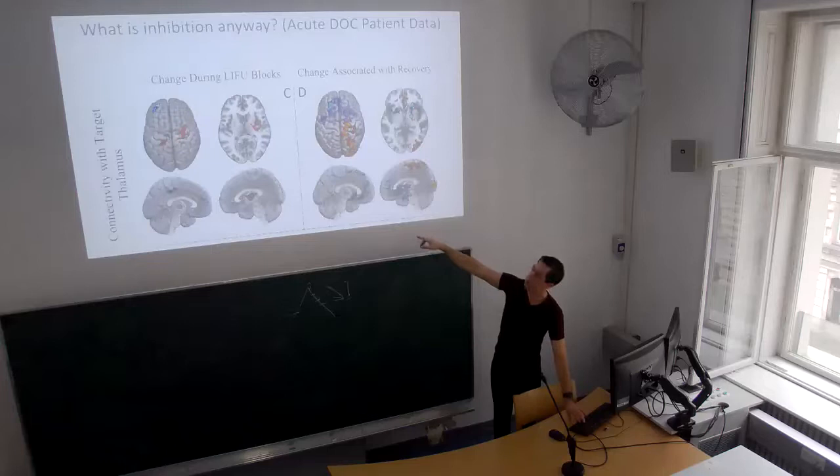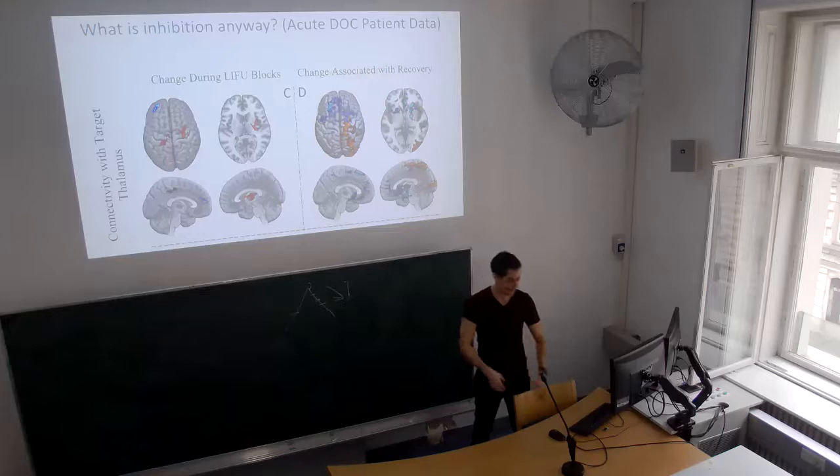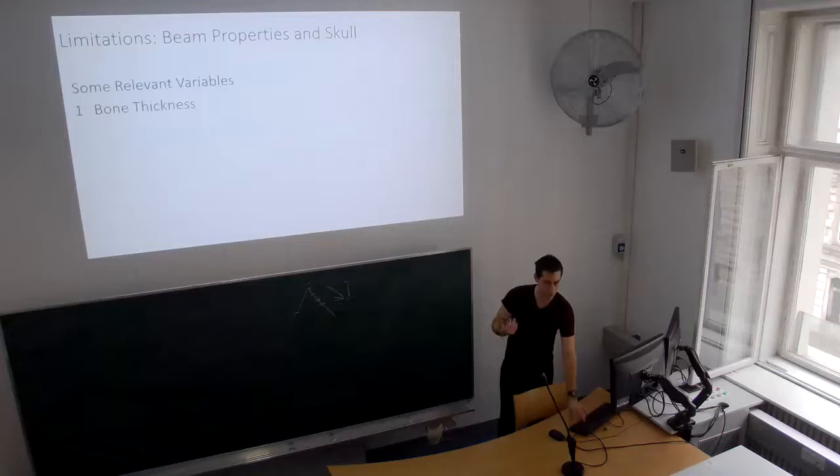We also see some differences in connectivity when the ultrasound is applied. Increases in connectivity, mostly, which is interesting. And this complex pattern is related to the degree of recovery. Those patients that recovered more had a greater decrease in connectivity between the targeted thalamus, just the targeted thalamus, and this bilateral cortical-subcortical patch here, and this ipsilateral posterior area. So that's related to the behavioral recovery. If instead you look at changes in the untargeted thalamus to the rest of the brain, you see nothing. So as a group, this healthy study I've done, this acute study, and a chronic study that's not published yet but will be soon, collectively I think is more compelling than any one piece. And I would encourage anyone to look at the details if you're interested.